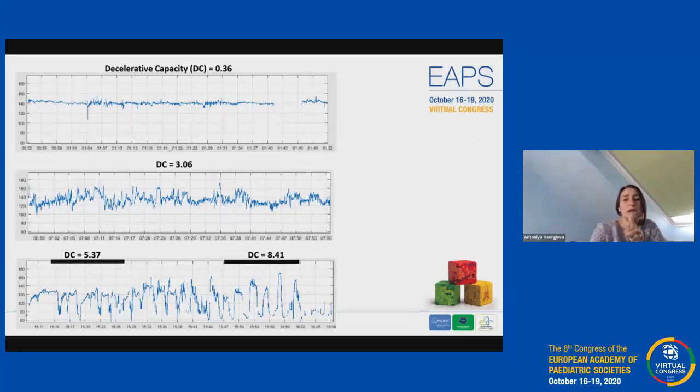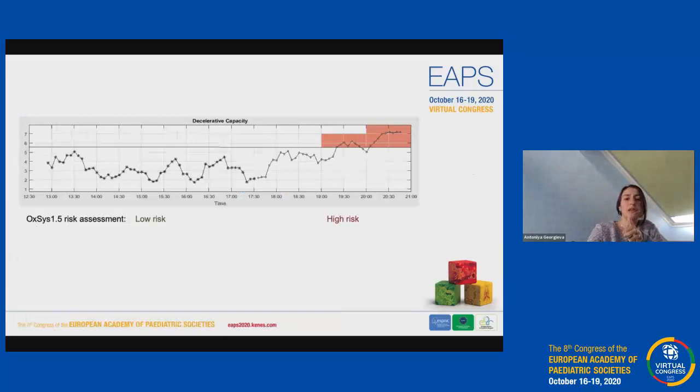It's intuitive clinically, but it's actually really robust to signal noise and signal loss, which are very common in the CTG. And as you could see from the bar graphs before, they could work as well as clinical practice or even better, and can be optimized on the data.